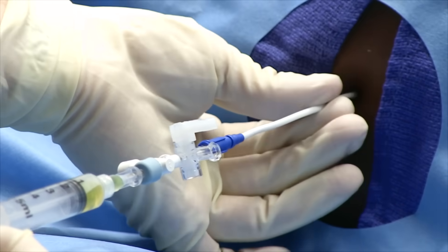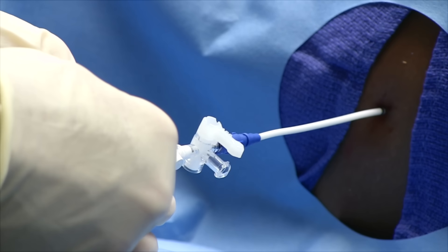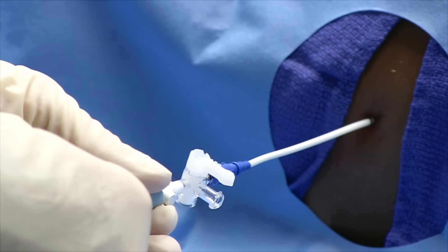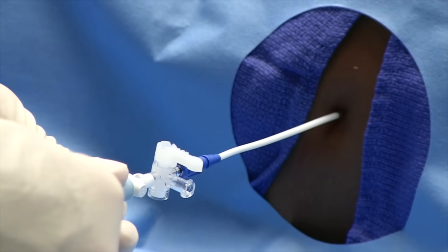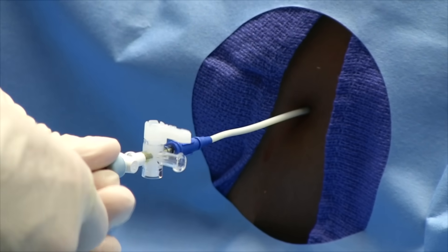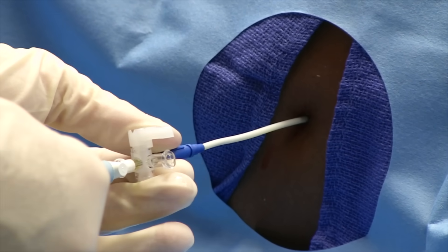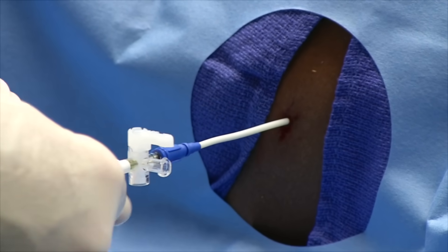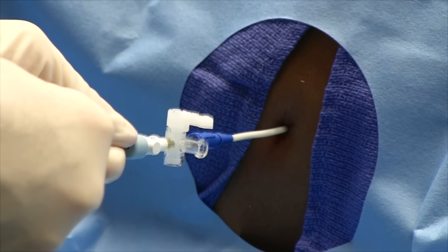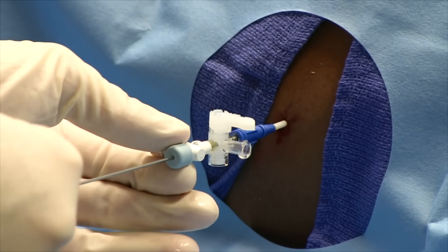Excellent. Now start to feed your catheter in. If you pull it out right now you need to leave some backbone for your catheter — so advance a little and make sure it offloads nice and easy. Slide the needle out as you advance the catheter forward. The catheter is pigtailed so it shouldn't cause any damage. Use the needle like a Seldinger technique — now pull your needle fully out.